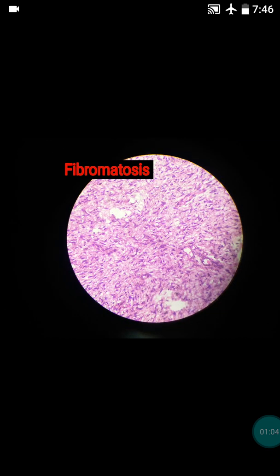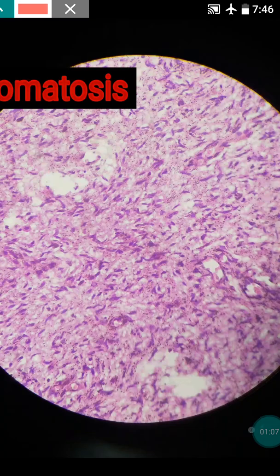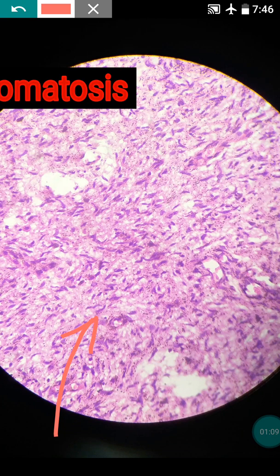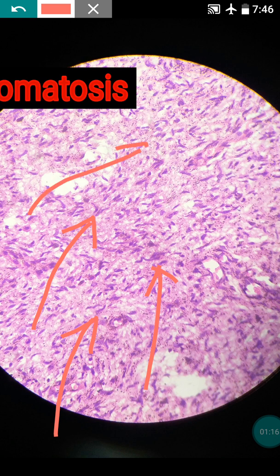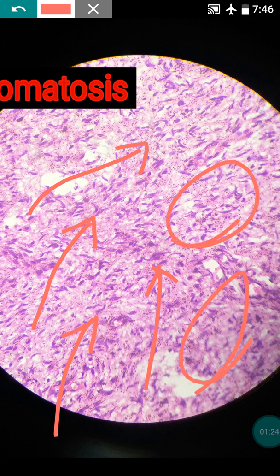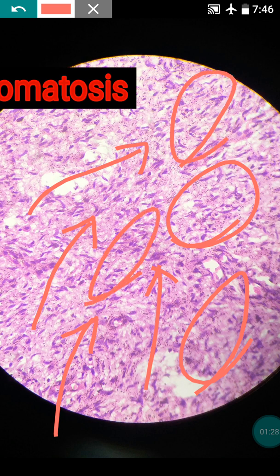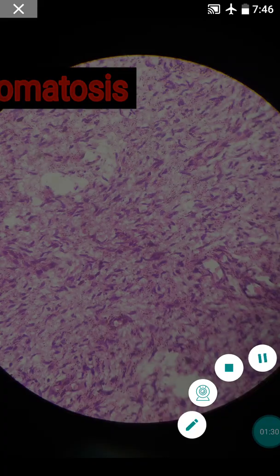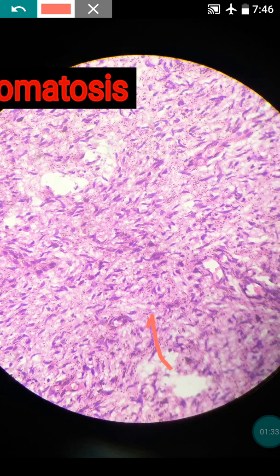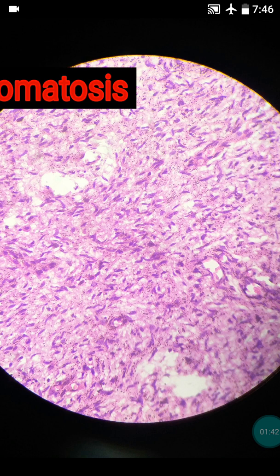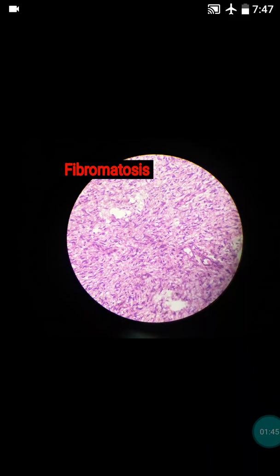Now we will see these four points in the high power view. In fibromatosis you can easily make out that there is presence of fibroblast proliferation — they are bland spindle cells. Pleomorphism, atypia, and mitosis are typically absent; these are purely benign cells. There should also be presence of collagen in between the proliferated cells — you can see the pinkish collagen between the proliferated cells.